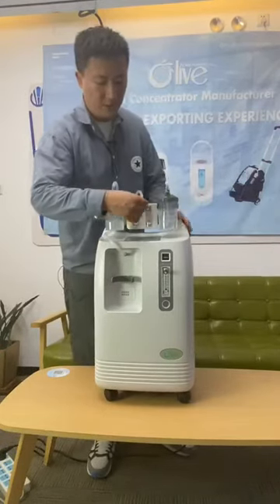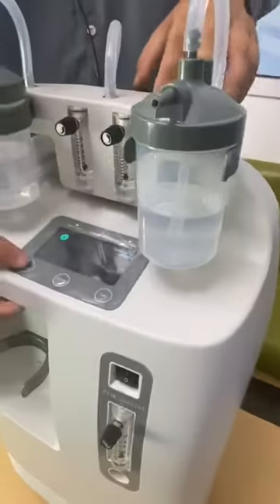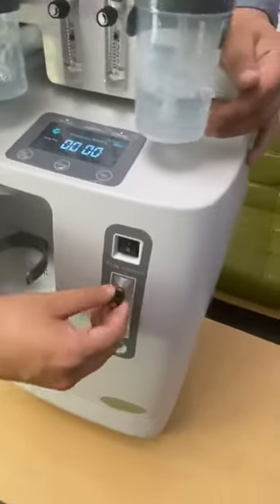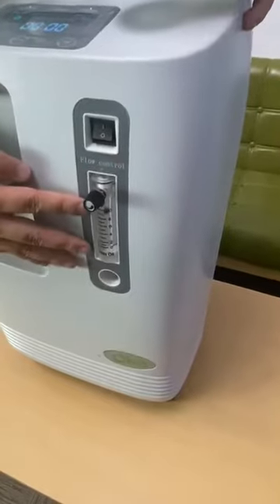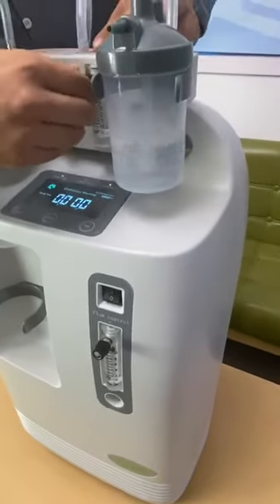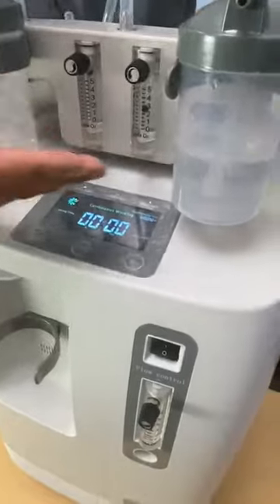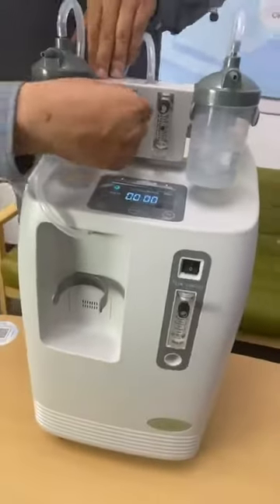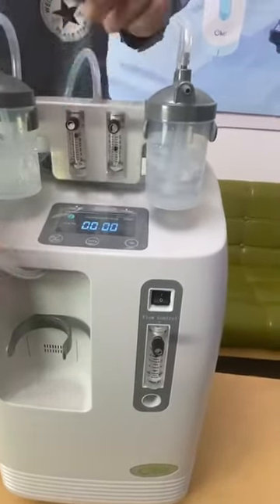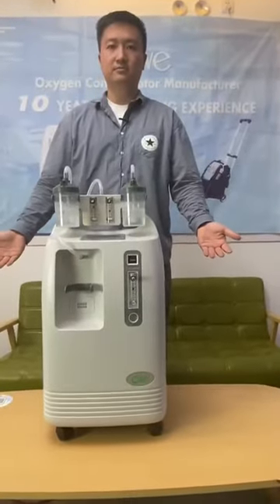You can individually adjust the flow rates. Turn it back on and adjust the settings to 10L at your primary flow meter. For example, for the left user you can set it to 3L, and for the right user you can set it to maximum flow, at 5L. It's all adjustable for two users.